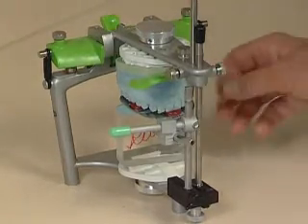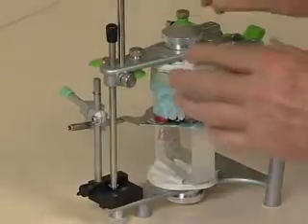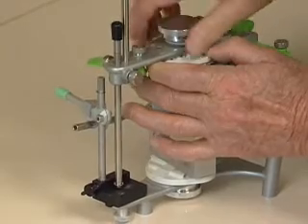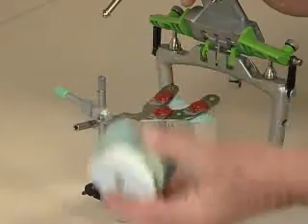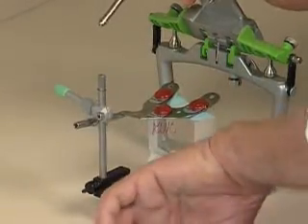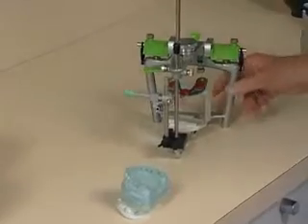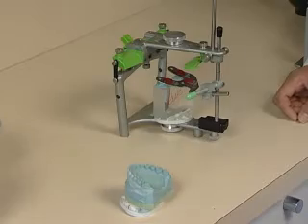Once I know my mounting stone is hard, I loosen it and lift the model to open the articulator, then lift the model out. That way I know I'm not going to break off any teeth. Once we have our upper model off for the moment, we can take off the bite fork and everything.